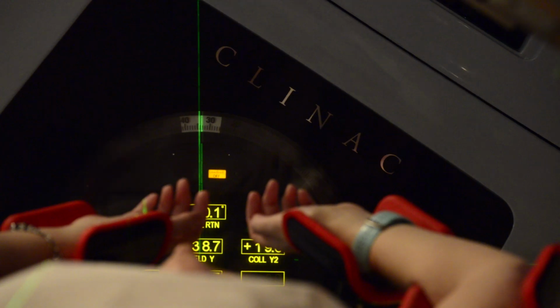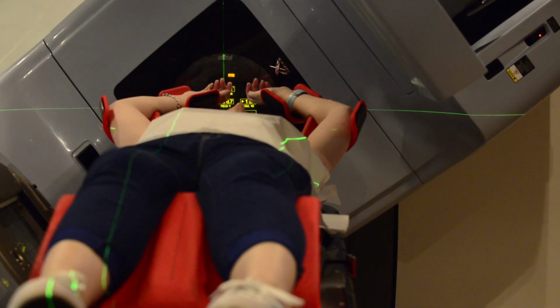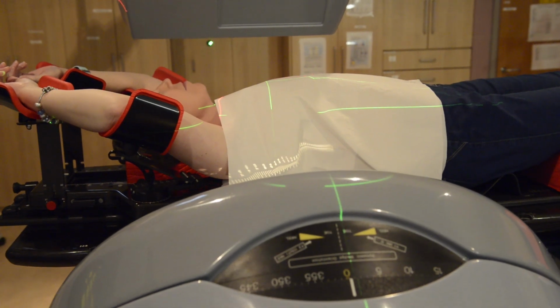It's very noisy. It's a little bit like waiting for the beeps that you get at the end of a dishwasher cycle. It's kind of like that. Towards the end of the process, you get to know what point that is of the treatment, so you know whether it's the beginning, the middle or the end. So yes, there are noises to let you know that something is going on, but it's completely painless. There's no pain whatsoever, no discomfort.